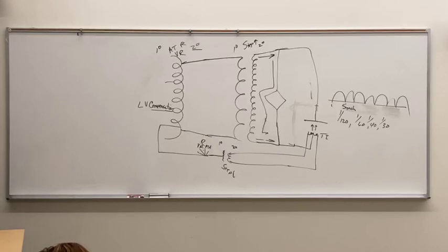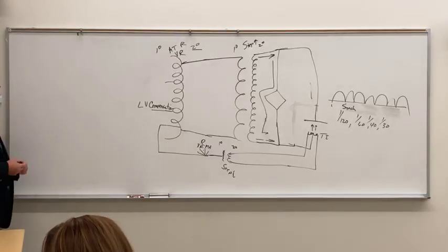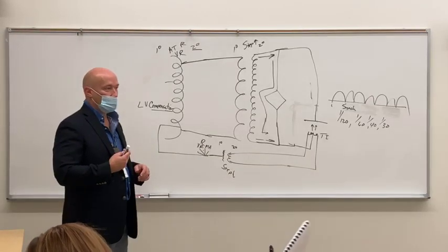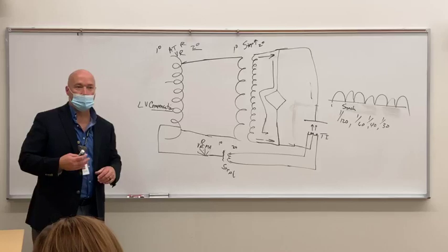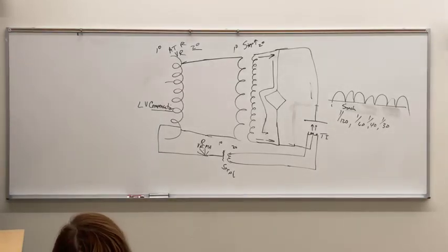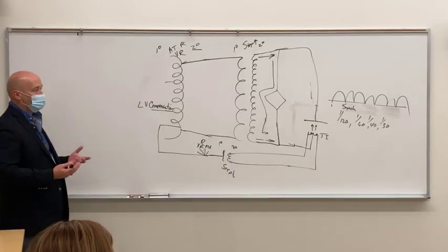Then we talked about the different types of automatic exposure controls. We've got photodiodes. Photodiodes are behind the image receptor, and ionization chambers are in front of the image receptor. So the characteristic of the ionization chamber is it has to be radiolucent, right? So it has to be radiolucent, but regardless of which type you use, it's just a counter for radiation.